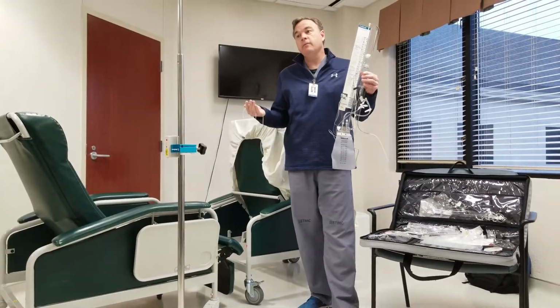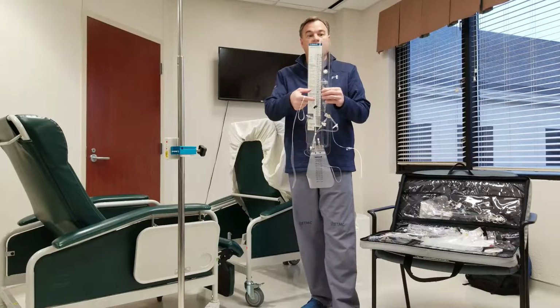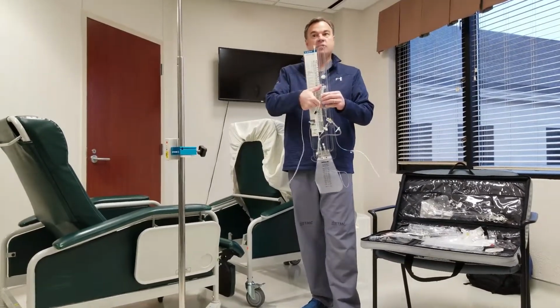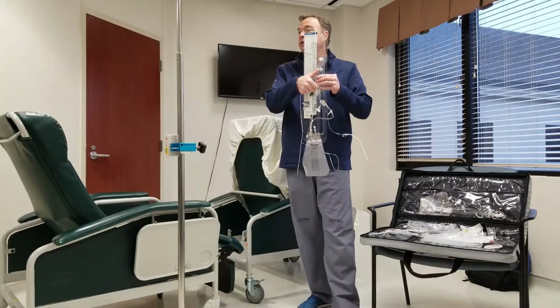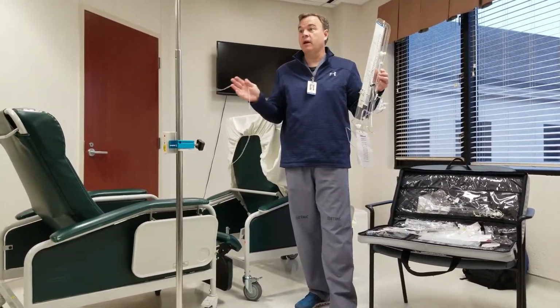The volume method is very simple. Every 8 hours you're taking off a certain amount, and it's cut and dry. You open it up, the chamber fills up. When you get to whatever it's written, let's say 40 mLs is a pretty common thing, then you shut it off and you're good, probably for the rest of your shift, and you don't really have to mess with it.